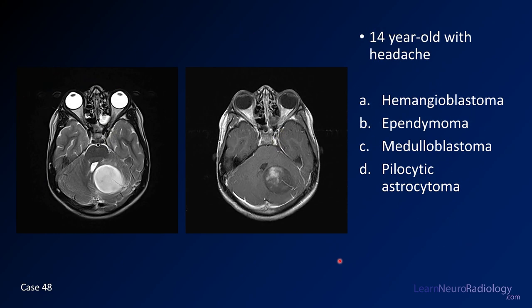Case number 48 is a 14-year-old with headache. We have images through the posterior fossa — a T2 and a post-contrast. Your choices are hemangioblastoma, ependymoma, medulloblastoma, or pilocytic astrocytoma.